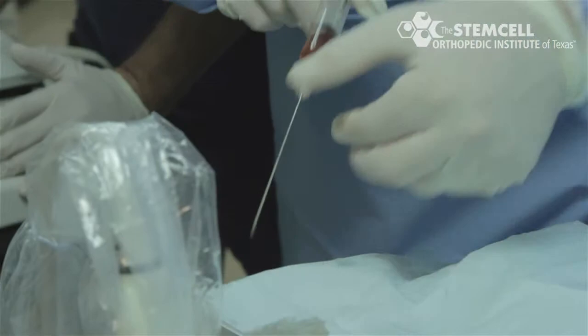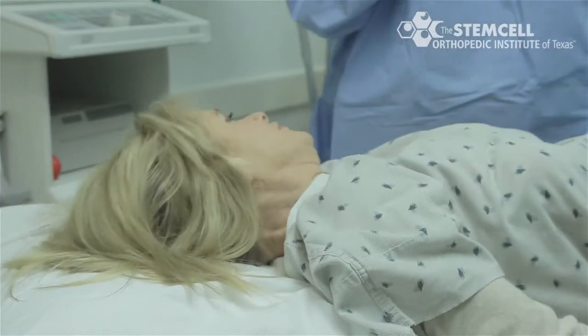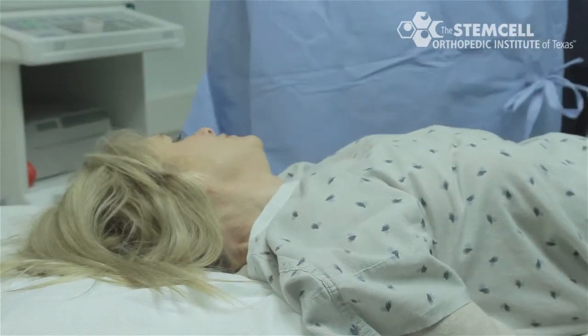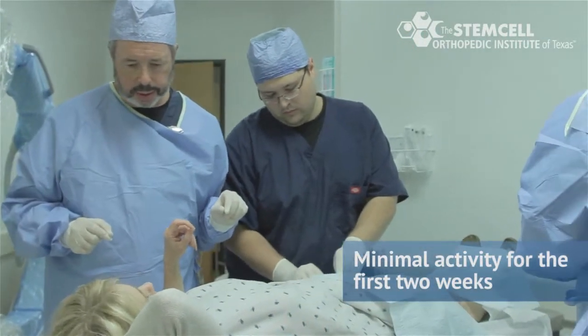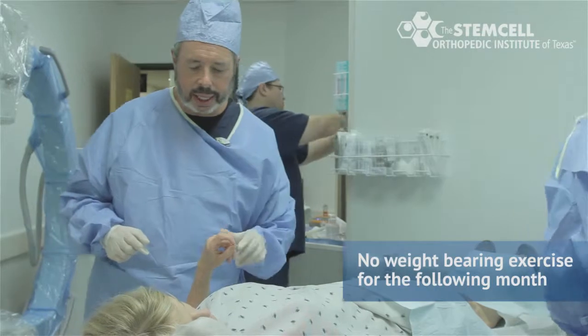After the stem cell and PRP injection, a bandage is placed over the injection site. The patient is directed to have minimal ambulatory activity for the first two weeks and no weight-bearing exercise for the following month.